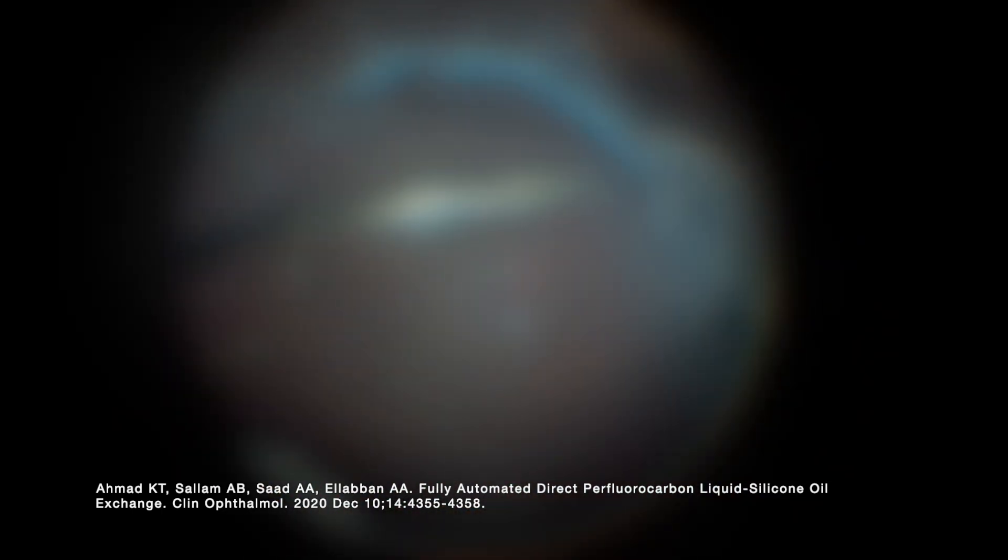So we decided because the retina shortened to go ahead and do a retinectomy. Here's a retinectomy using the shave mode of the vitreous cutter.